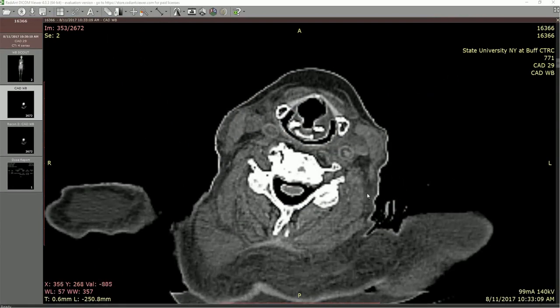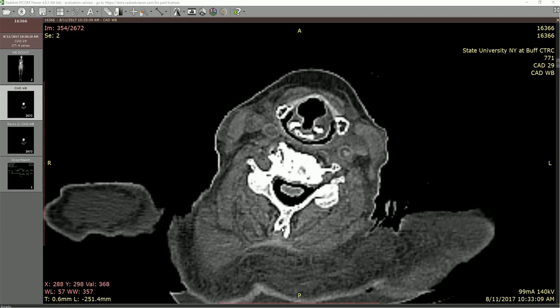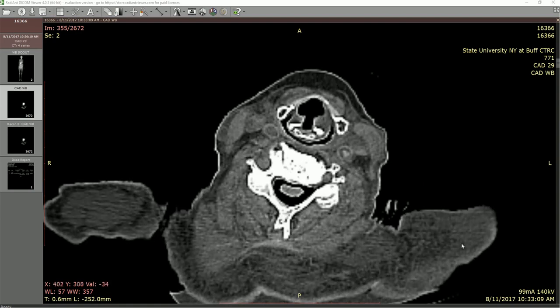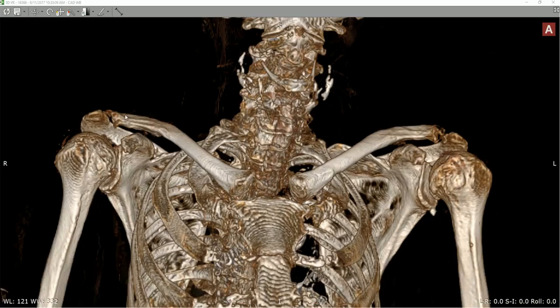Let's switch back to the CT view and continue working our way down. We can see the spinous process of the vertebrae — that bifid process we see in the cervical region. We're also starting to see a little bit of the shoulder. Remember we're looking from the feet up, so the shoulder on the right side comes into view a little before the left. Jumping to the 3D view makes sense because the cadaver was not positioned completely straight. If you're seeing one thing on one side and something different on the other, it doesn't mean there's an anomaly — it's just how the body is positioned.